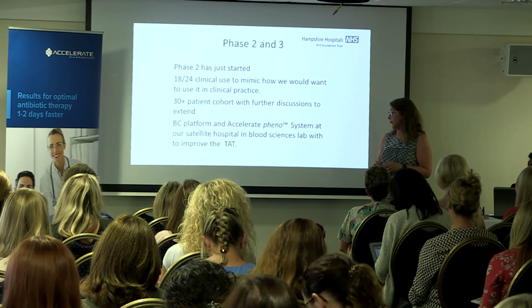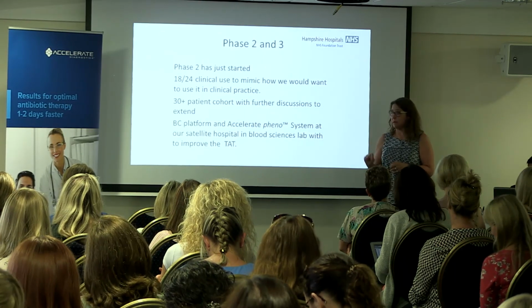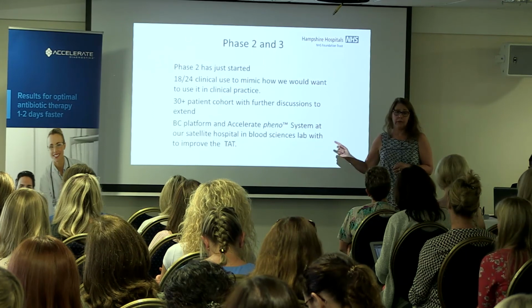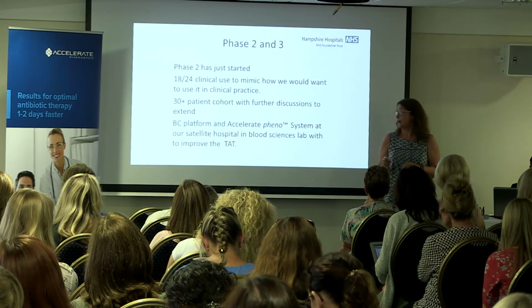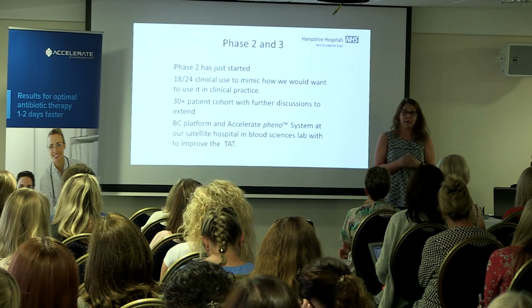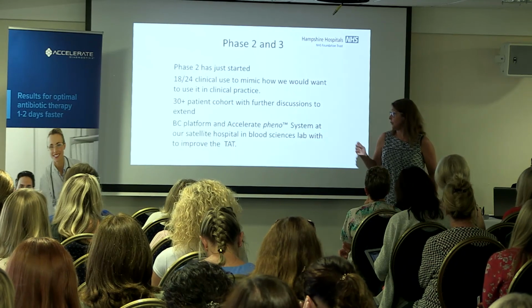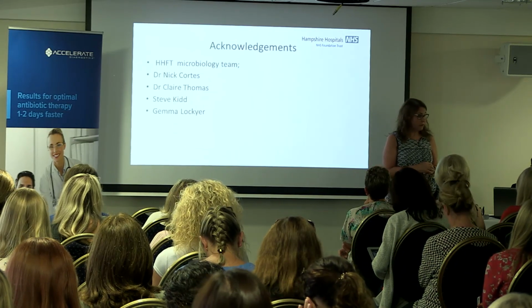As consultants, we get remote access for the result. So our only issue at the moment is having someone to remotely read the gram stain, because the BMSs are happy to do a gram stain, but because they're hematologists and biochemists, they don't want to read it. So we want someone remotely to read it. So we're hoping to look at that in the near future.